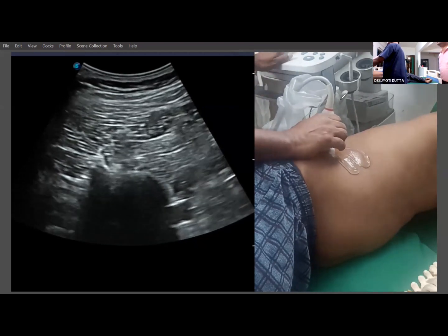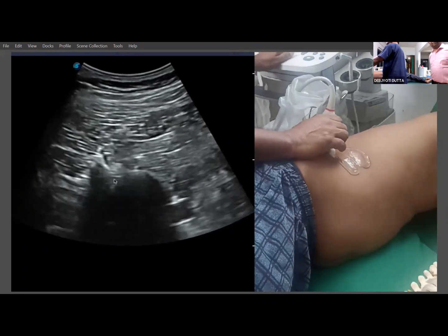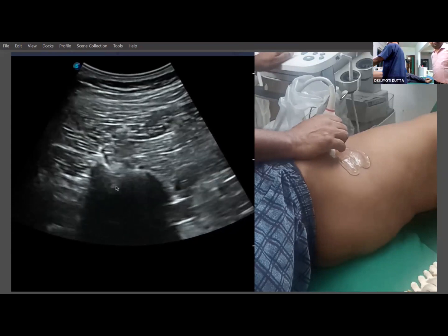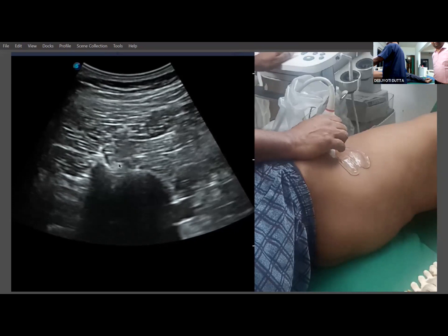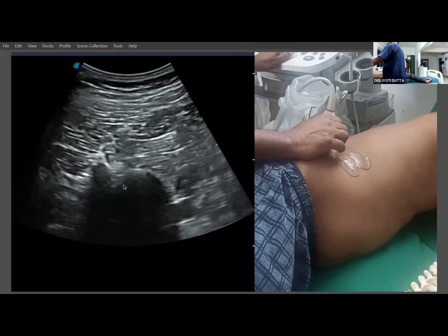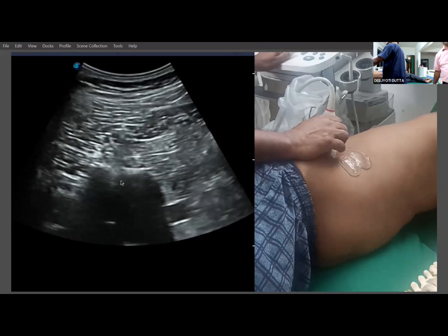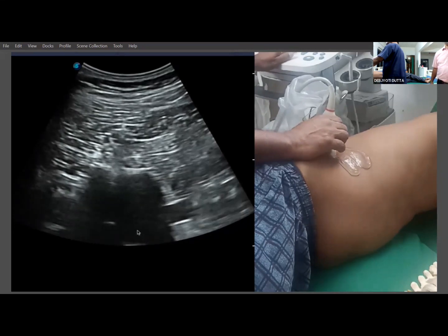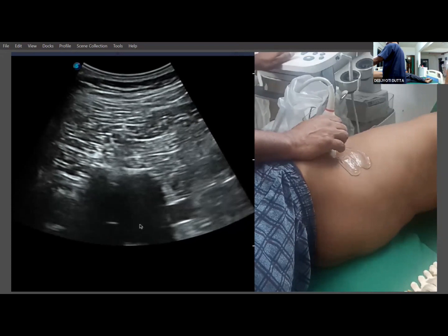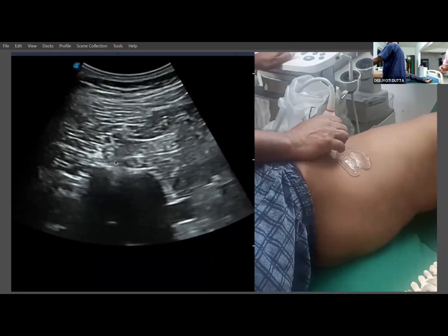What you can see is the pulsation there. So these are the foraminal vessels, and at this level you can see the nerves which are coming down and forming the lumbar plexus. So this is the foramen. This is at the level of the disc. Why? Because the shadow is going down, and you can see the foramen very nicely. To study the foramen, you see the pulsations there. You can see this is the spinal canal, and you can see it is going through the bridge. This ultrasound beam is going through the disc, and you can see the foramen. So this is another way you can come from posteriorly and inject into the foramen.